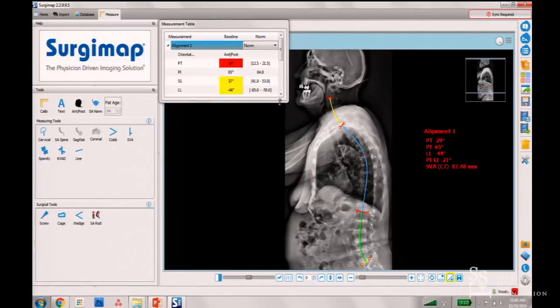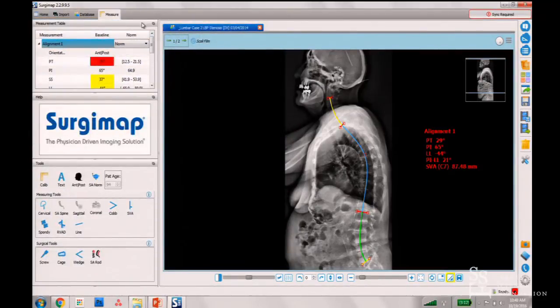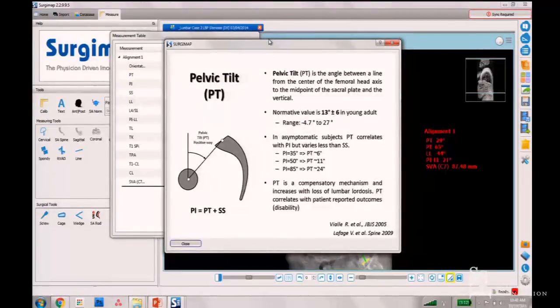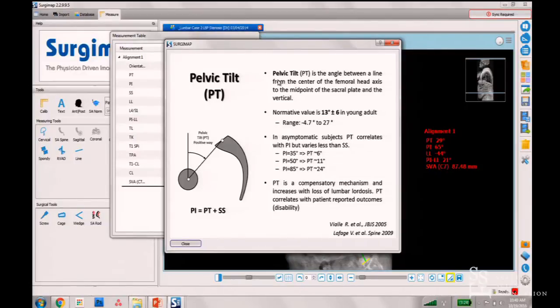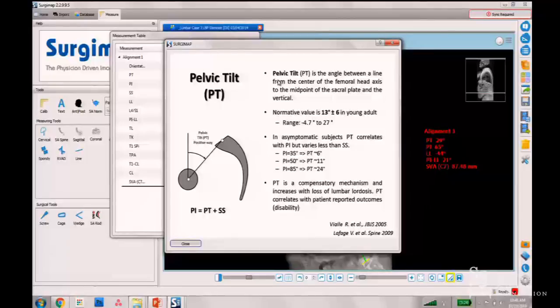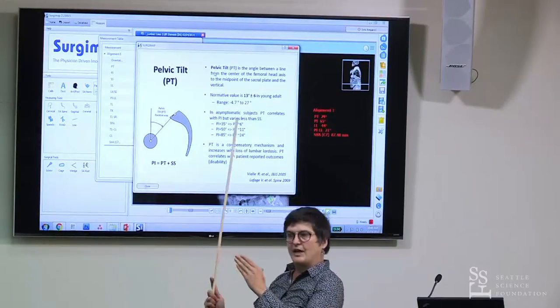On the left you get the orientation of the pelvis. If you click on each parameter, you'll see a definition. The pelvic tilt measures the orientation of the pelvis — remember we start with the pelvis because it's really the foundation of the spine. When pelvic tilt increases, it means the pelvis rotates backward and brings the spine back into a vertical position.